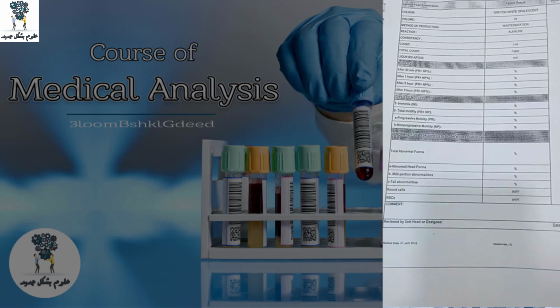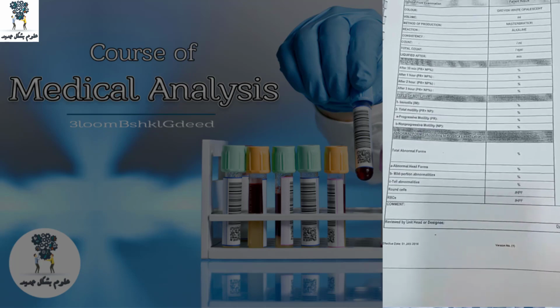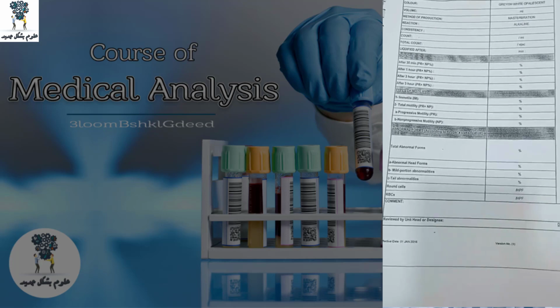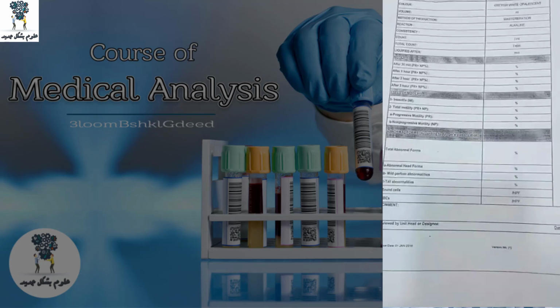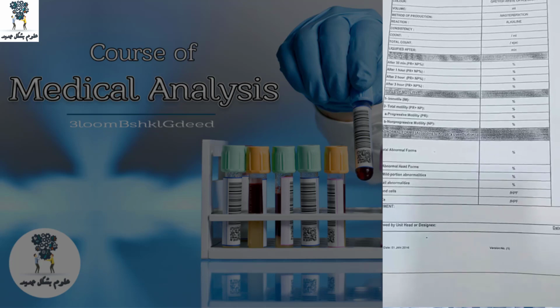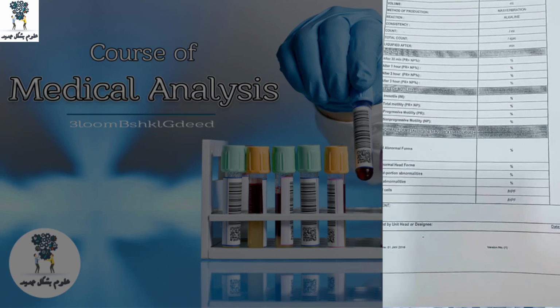At first, we will write the color that we identified, the volume, the reaction, whether it is acidic or alkaline, the consistency, whether it is normal, viscous or hyperviscous, and comments that we identified from the first slide, whether it is 4 or 5 sperms or 2000 sperm.